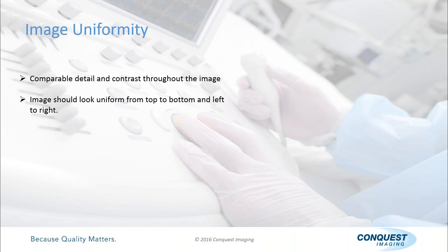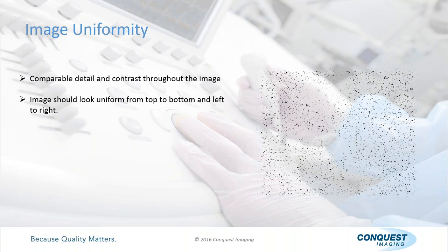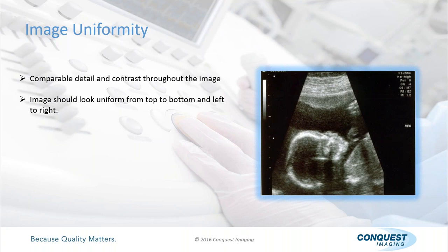We also talked earlier about image uniformity, and image uniformity is basically saying that you want comparable detail and contrast to the entire image, and the image should look uniform from top to bottom. And what I mean by that is if you look at this image, certainly there are different density materials that make it appear that there are areas of darkness and white. But in reality, from top to bottom, this is a very uniform, clear image, as well as from left to right. So this is indicative of an image that you would be looking for.